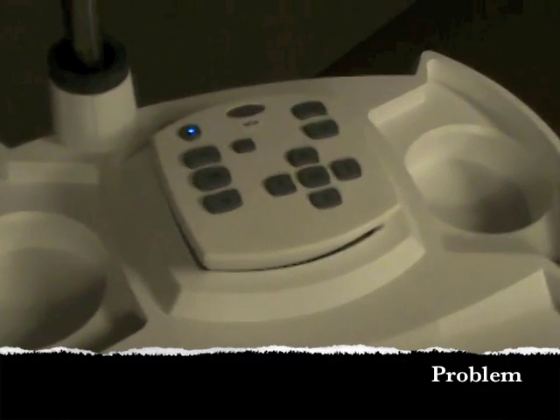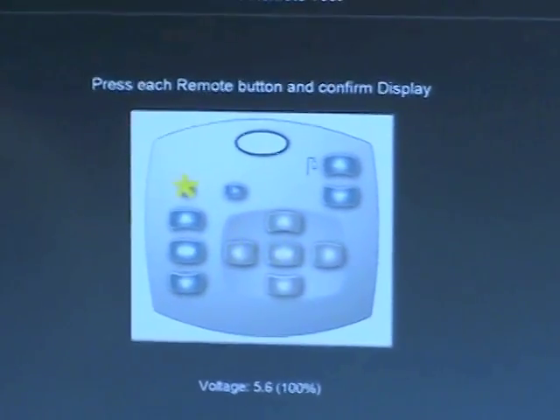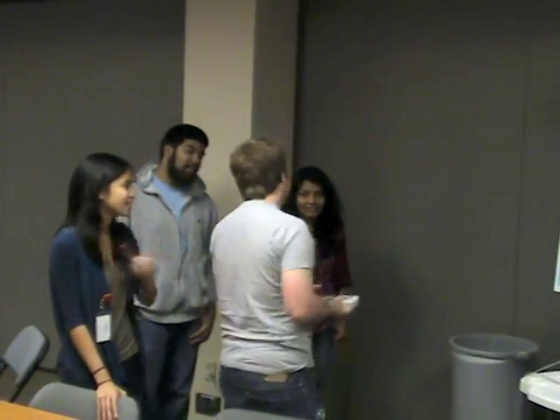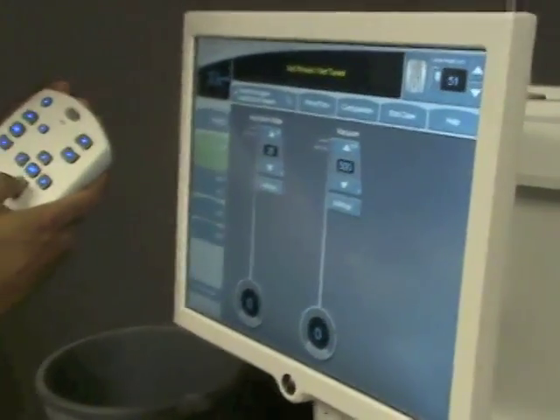The fundamental problem the remote control presents is that it is not intuitive for users. The remote control itself consists only of directional buttons and select buttons, making it difficult to actually navigate through the settings and functions of the White Star system. The controller even lacked labels, so oftentimes the users were not sure what each button's function was. Many users also felt that the remote control was bulky and heavy and did not have a good ergonomic feel. Because of these problems, AMO found that very few nurses were actually using the remote control at all.